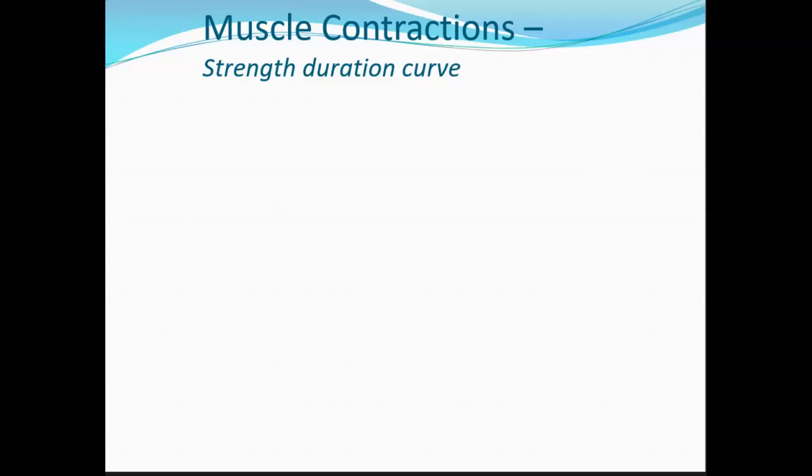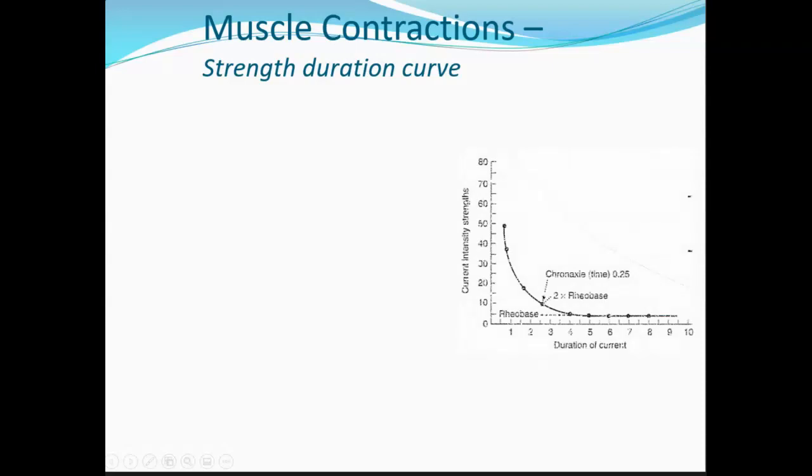I do want you to look at 247. There's a couple definitions that talk about motor level stimulation. I want to point your attention to the noxious level. Noxious is pain, right? And so there sometimes is a clinical goal of using e-stim to induce pain. Like, why would you do that? We'll talk about it. It'll come up. But let me put up my pictures.